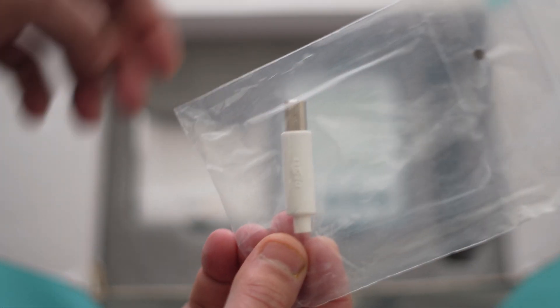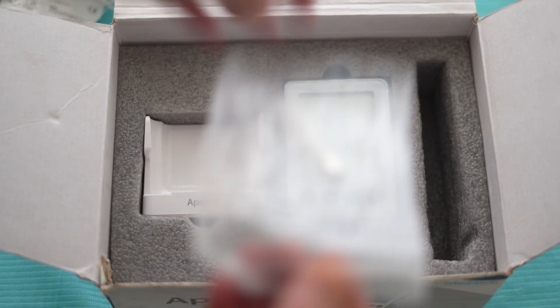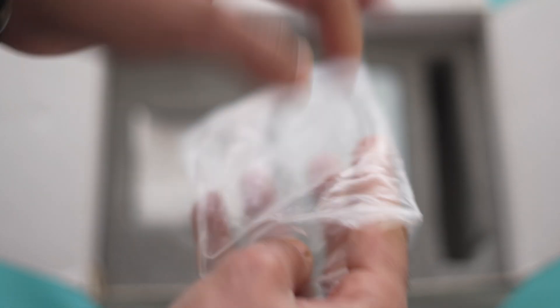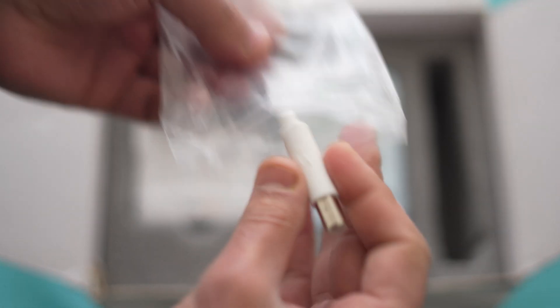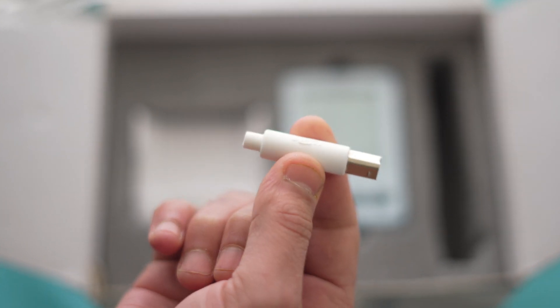The last thing the Apex locator comes with is this checker. This is an important tool that comes with the Apex locator — it shows you that your Apex locator is ready to use. How to use this checker I will show you later in this video.